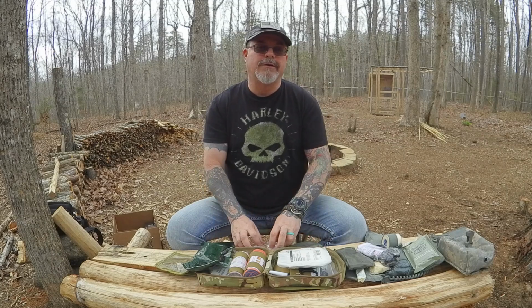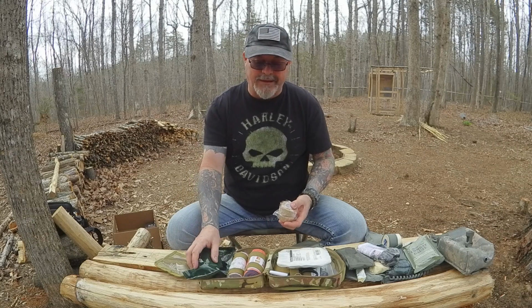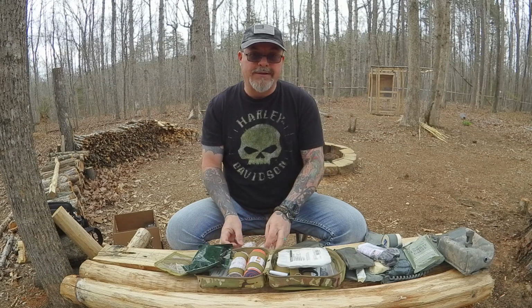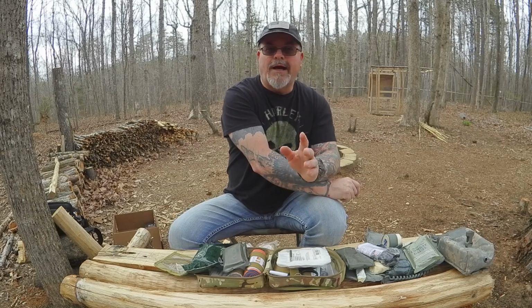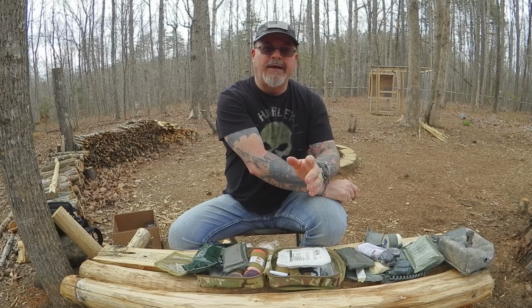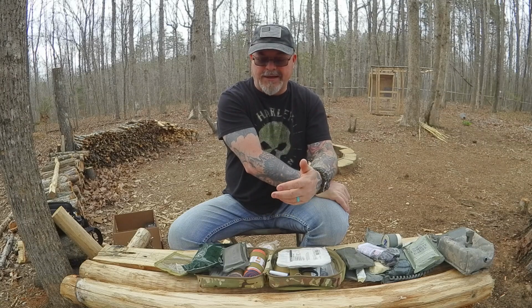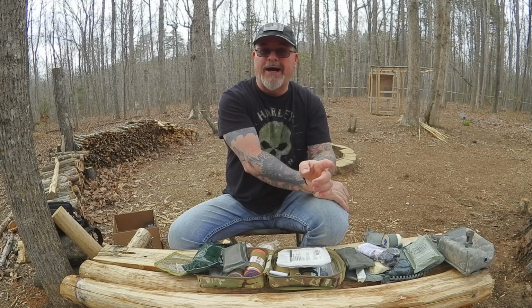And the main thing you want to make sure you have is some sort of medical supplies, so when you're out there by yourself doing your thing, if you get injured or hurt, you can take care of yourself. Because the thing with these kits is they're about stopping the bleeding so you can get to help. Understand that. These kits aren't designed to fix you up like you went to the hospital and then you just go about your day. These kits are designed to stop major injuries, so you can get help, so you don't bleed out or die where you're at.